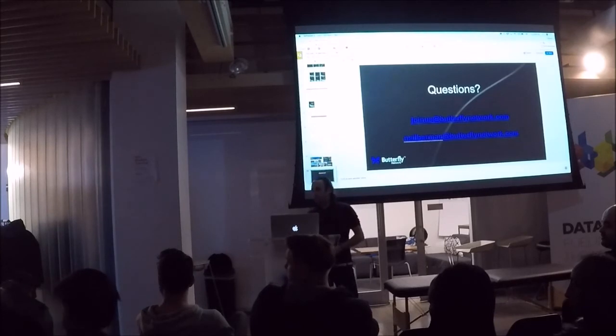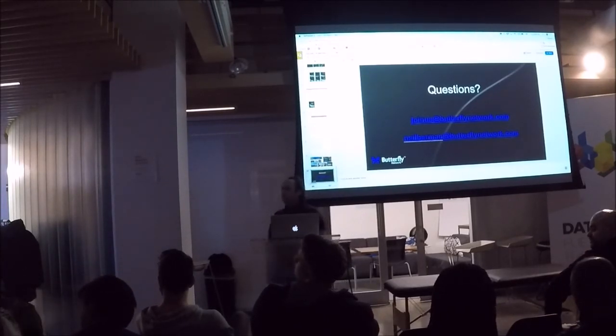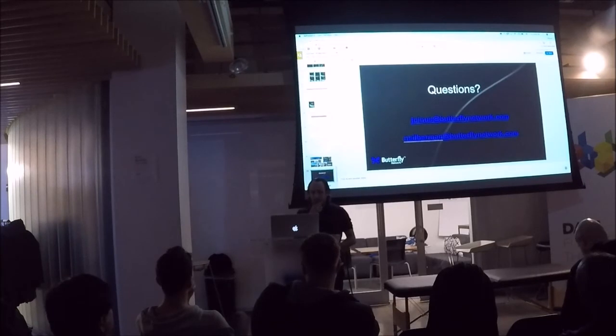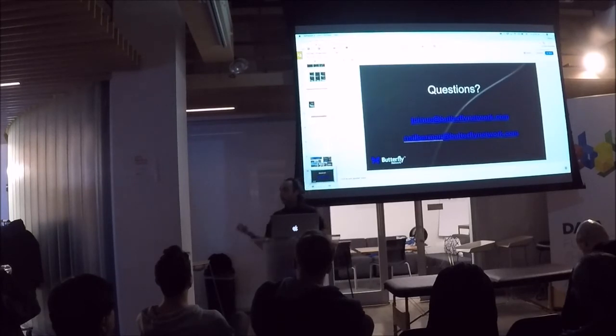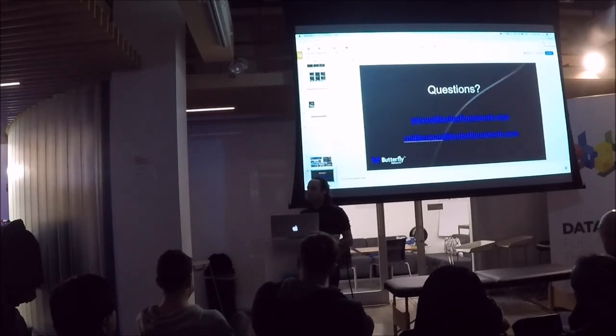So what are the next main hurdles for implementation and the actual patient use? Well, one of the biggest is something I mentioned earlier in terms of clinical validation. In the academic world, and maybe certain industrial applications, 98% accuracy is good enough. Obviously in the medical space there's a much higher hurdle to cross in terms of accuracy.